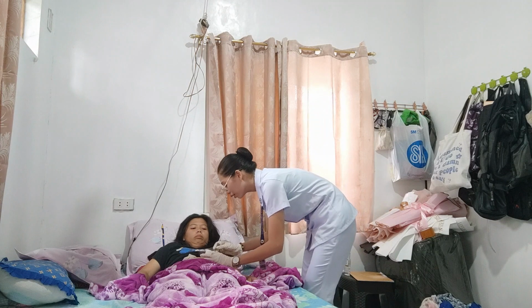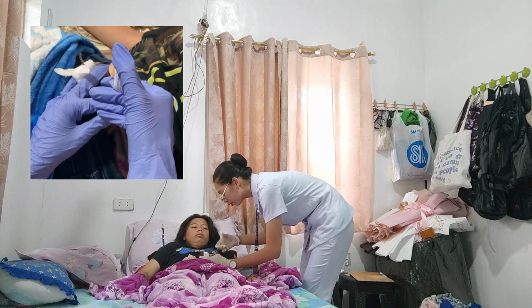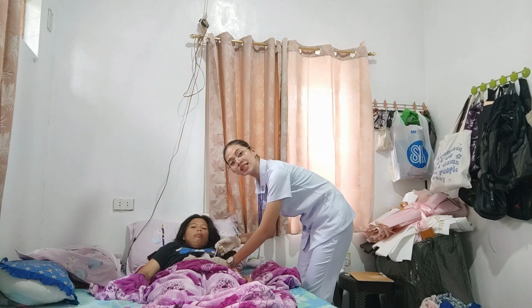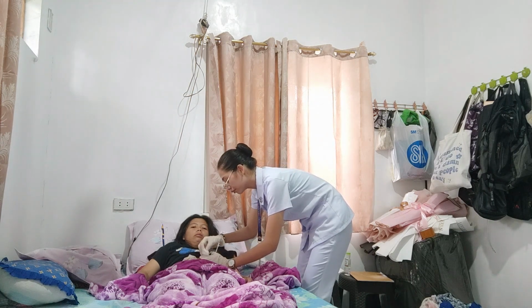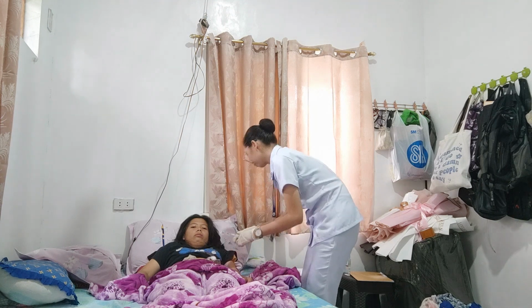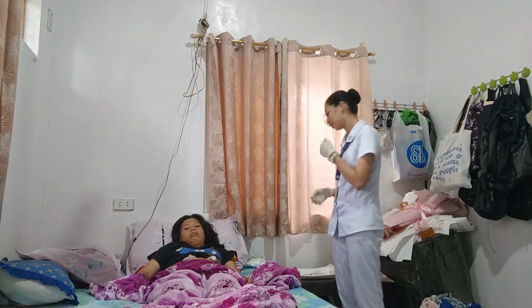Okay, ma'am, I'm going to insert. Now, quickly withdraw the needle and place a swab or gauze on the site and apply gentle pressure, making sure you're not massaging the area. Okay. After administering the medication, make sure to dispose the supplies appropriately to avoid accidents and flip down medication ticket.